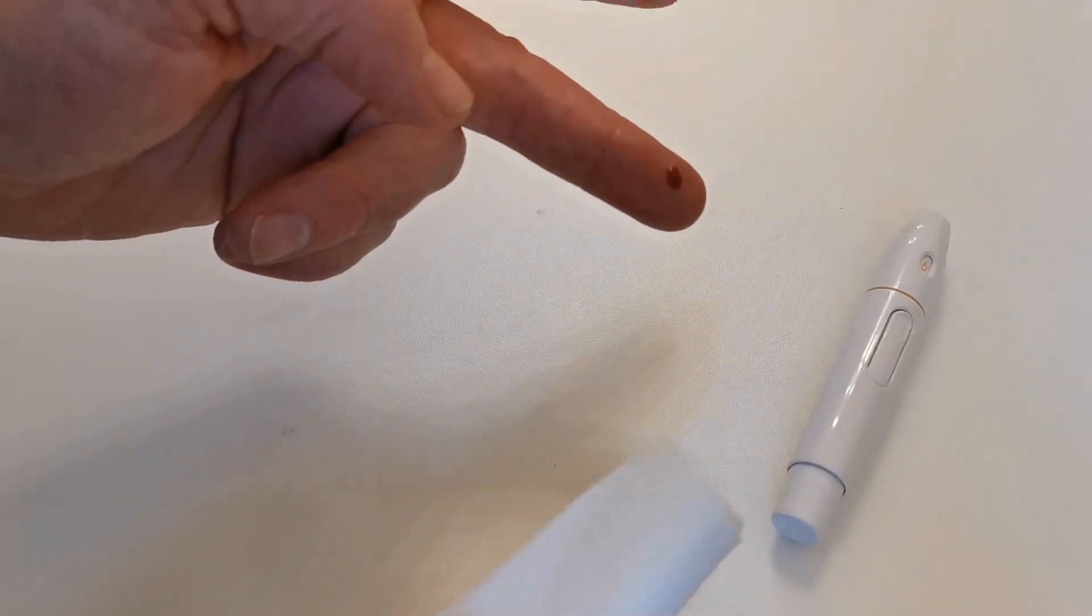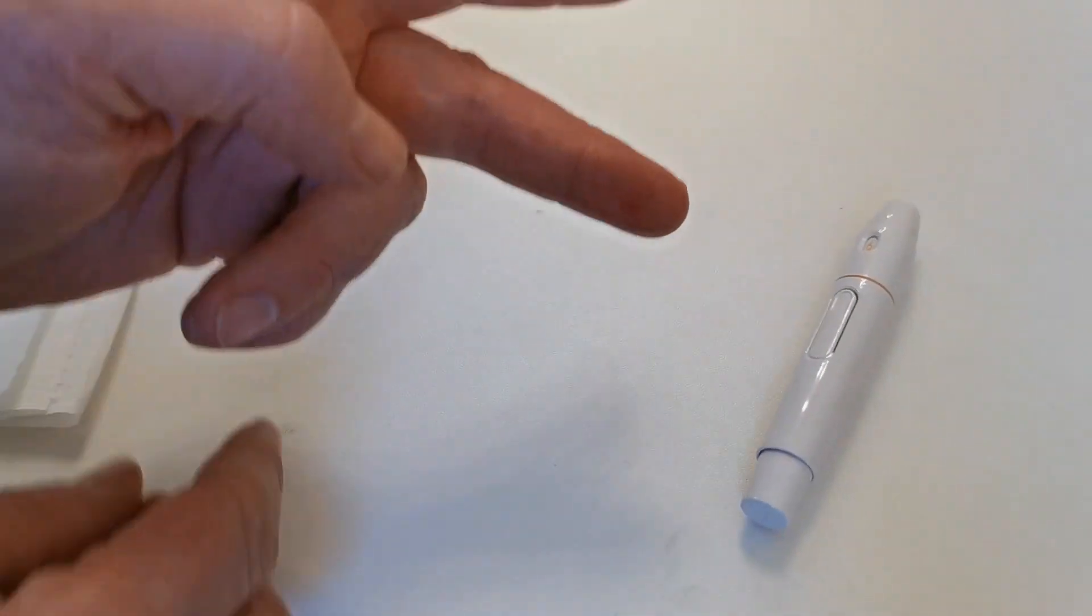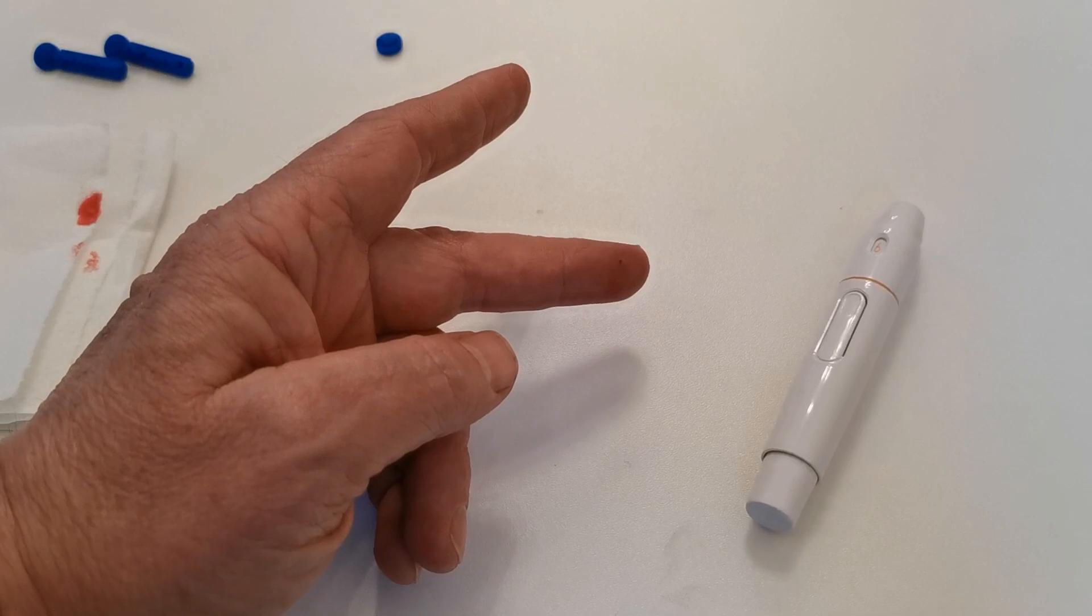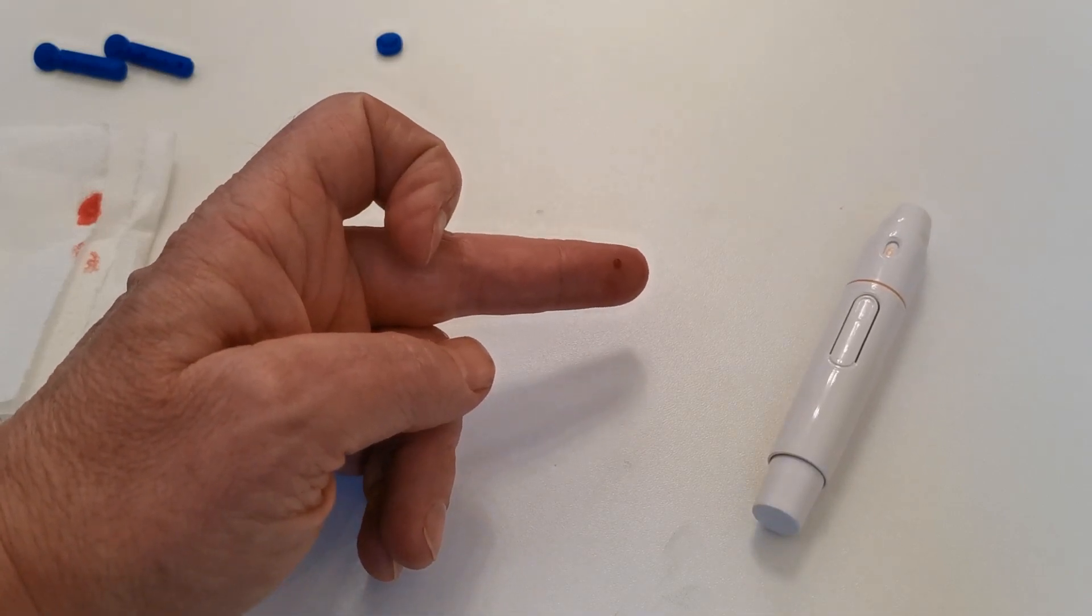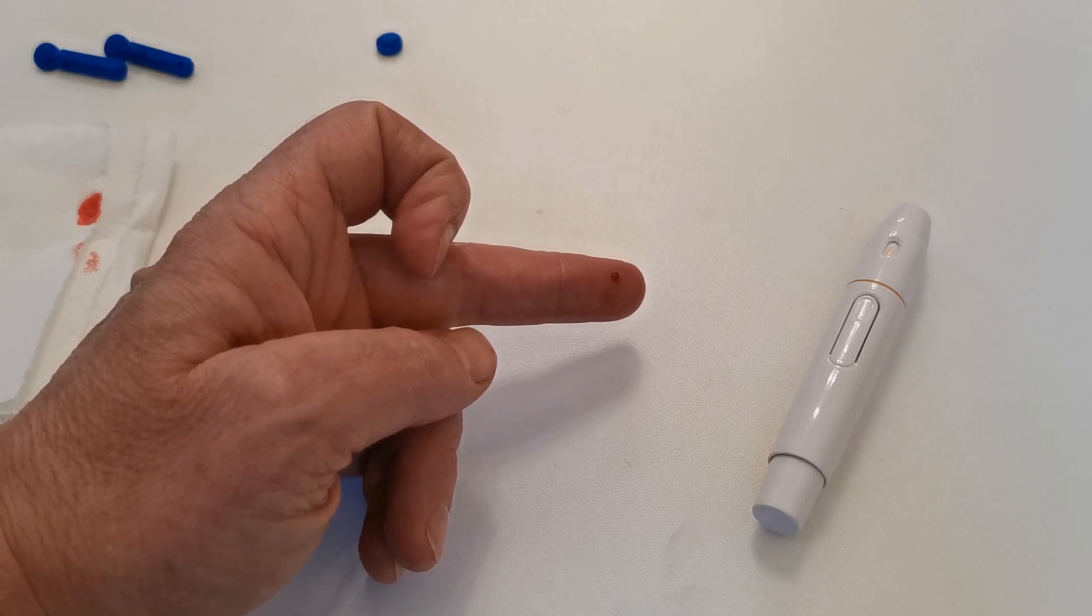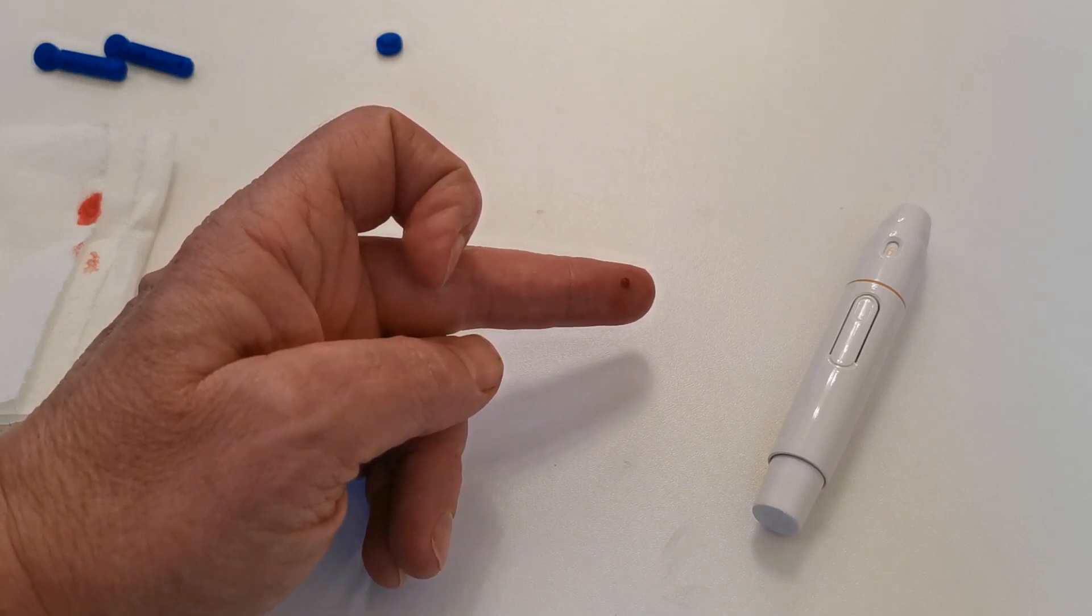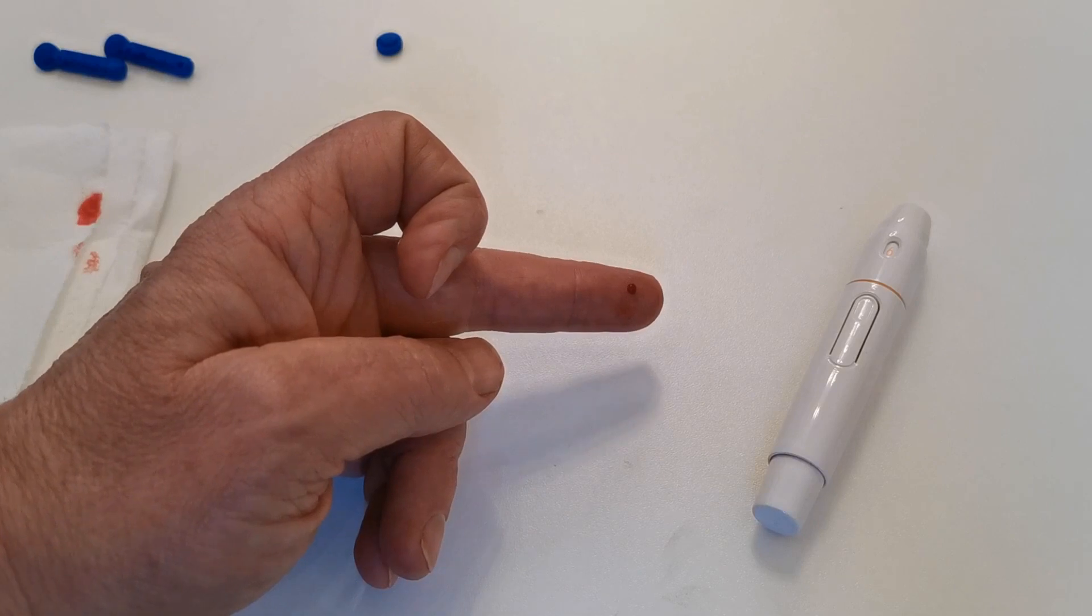First drop forms nicely, remove it. Allow the second droplet to form naturally. This may take a little time. Don't panic. If you've got the correct depth, then you should form this second droplet completely naturally. Do not squeeze the finger or finger pulp.